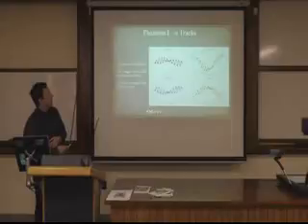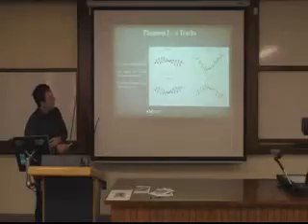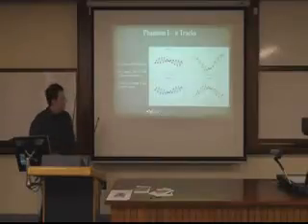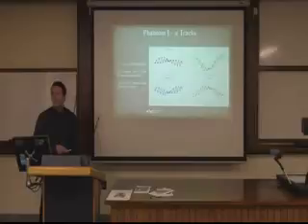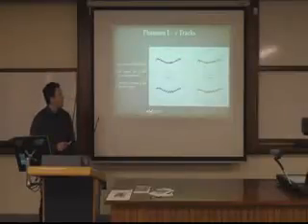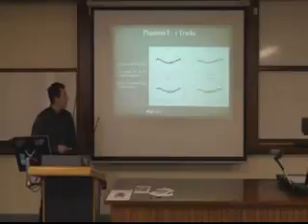You can see here, there's a large arc, and then you've got the 10 RPM sinusoidal, one for each marker. A large arc here indicates that it would be more off-centered, so this is due to gantry rotation, and the smaller one is from the moving phantom. So more off-centered, closer to the centre of the isocentric rotation. So that worked well, but you can't actually do any numerical analysis on that because you can't repeat the situation. So it gives you a sort of qualitative result.